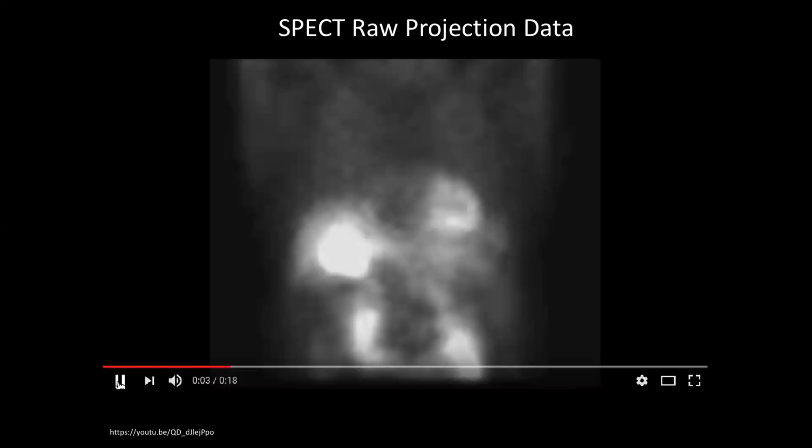In general, if you have a point source like in CT, it's a cone of radiation coming out. But here, because we have these septa on our detector, we can look at this and say, well, all of the stuff coming at any point in this 2D plane came straight up through the patient. Okay, so they're parallel beams through the patient. We don't really have a cone of radiation coming.